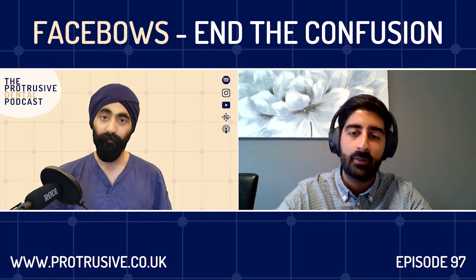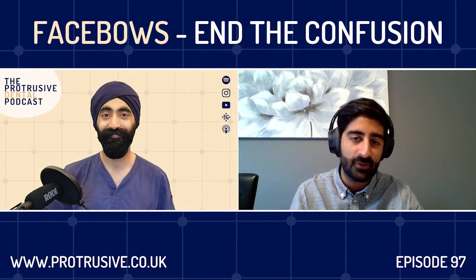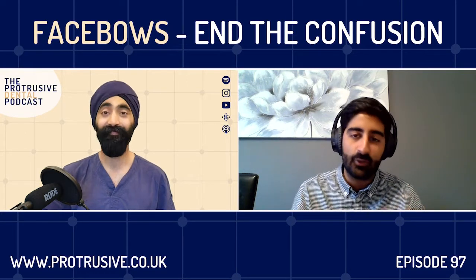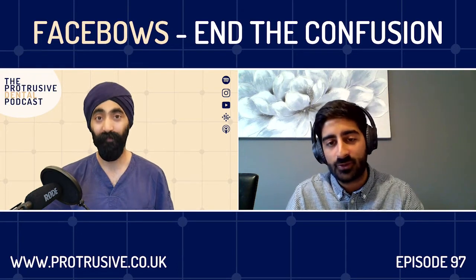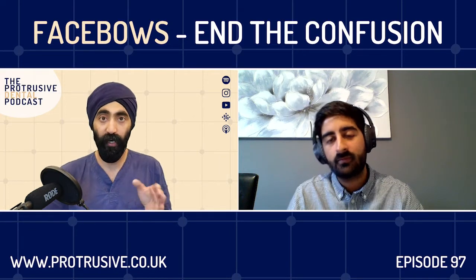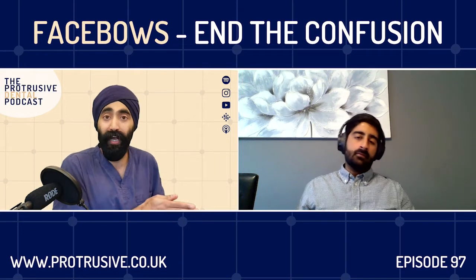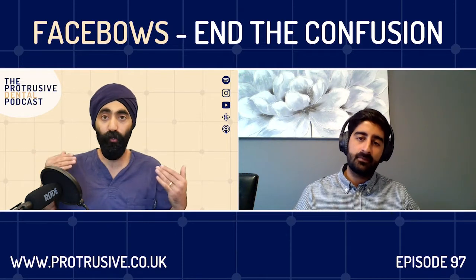Because the worst thing is you go through all of this and then the technician goes, your casts don't fit together on this Facebow, they don't fit together on the jaw relation records, what would you like me to do? So that's just a little tip out there. Separate the appointments, it makes life so much more stress-free. That's so true, and it gives you that confidence that, okay, the first phase was correct, now you can move to the next phase, being the wax-up, and you know that you minimize your errors, your accumulated errors.